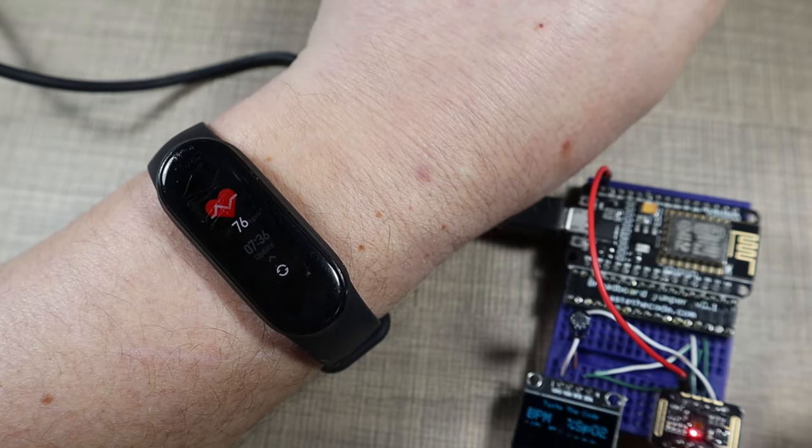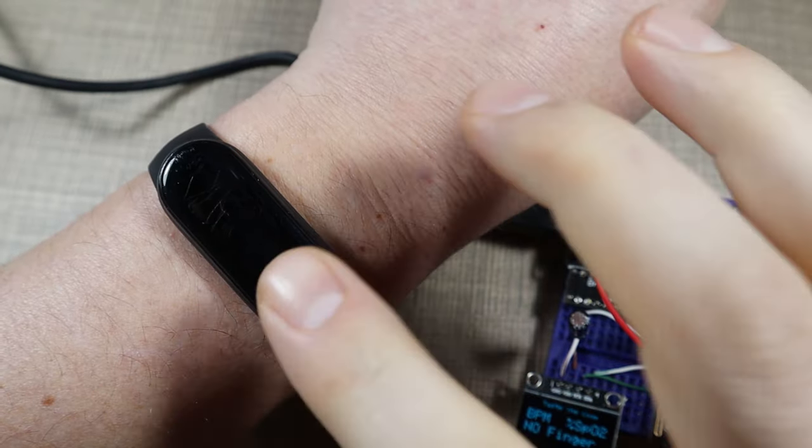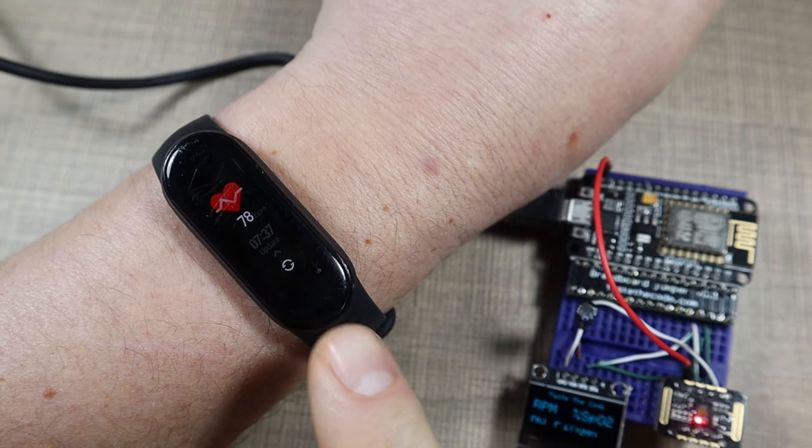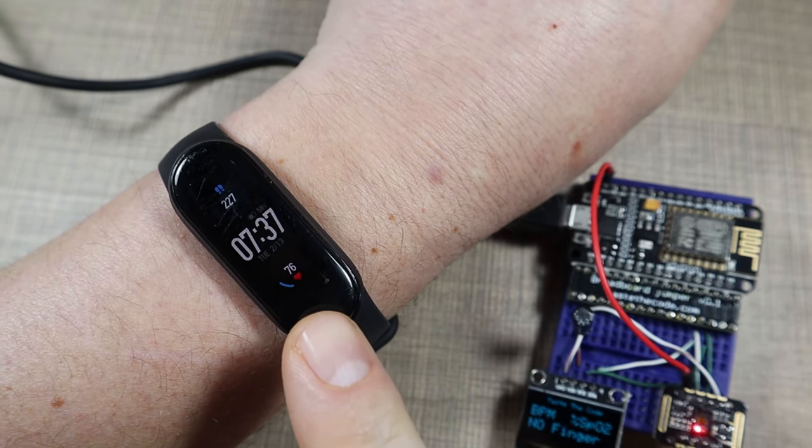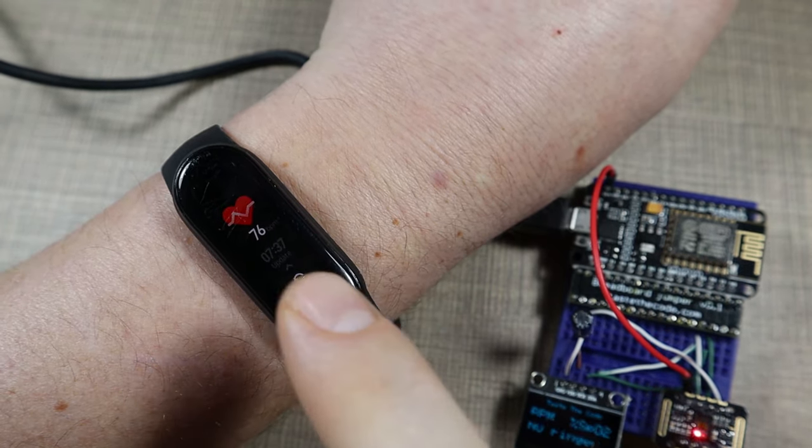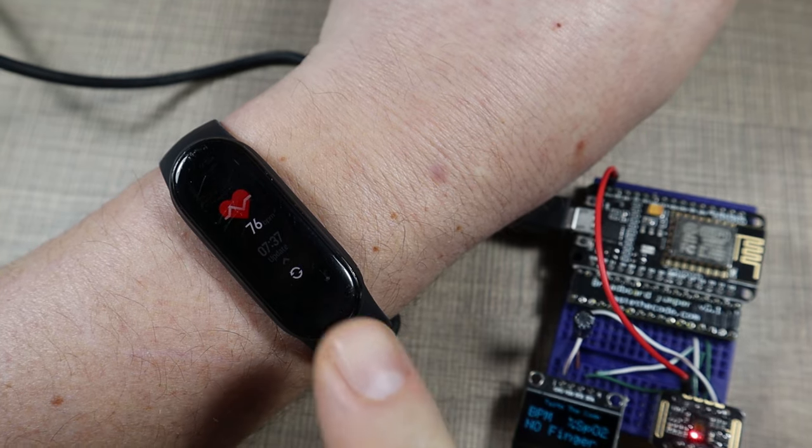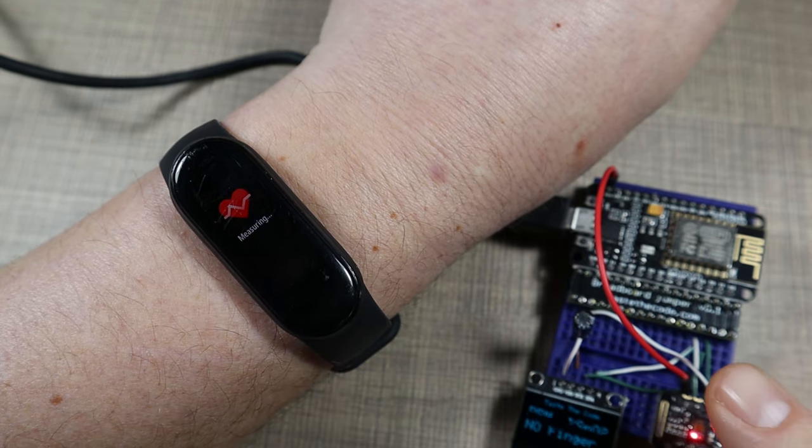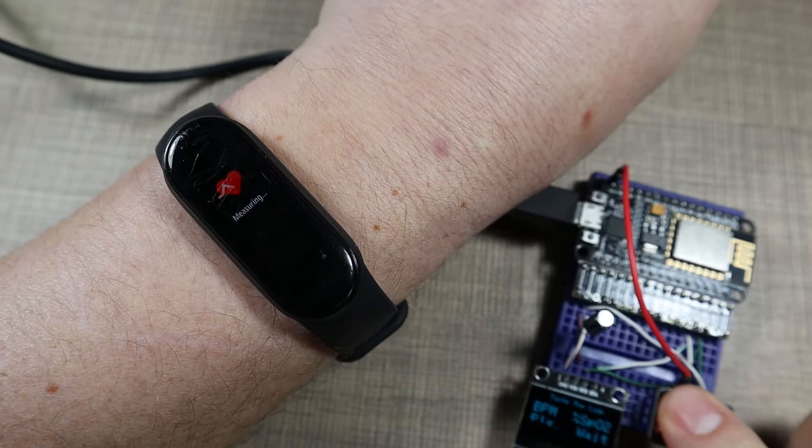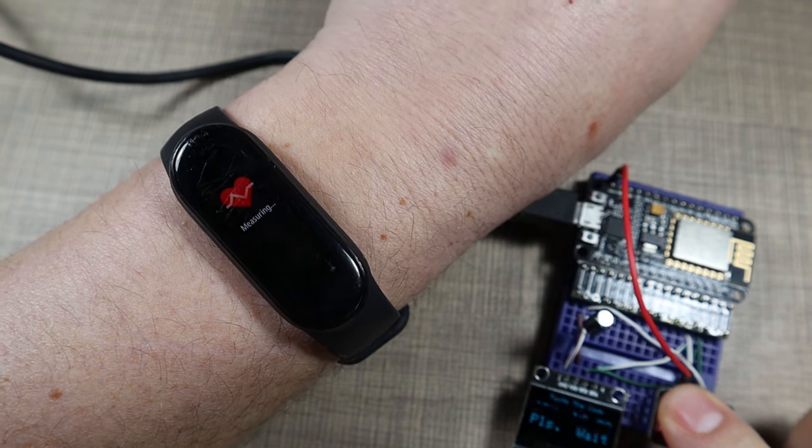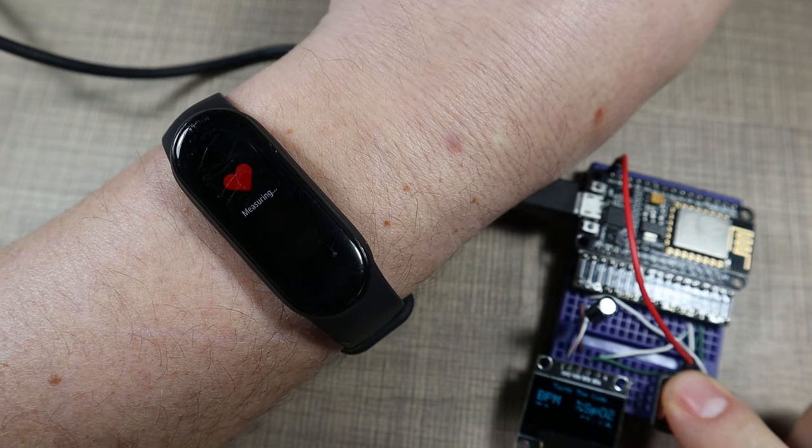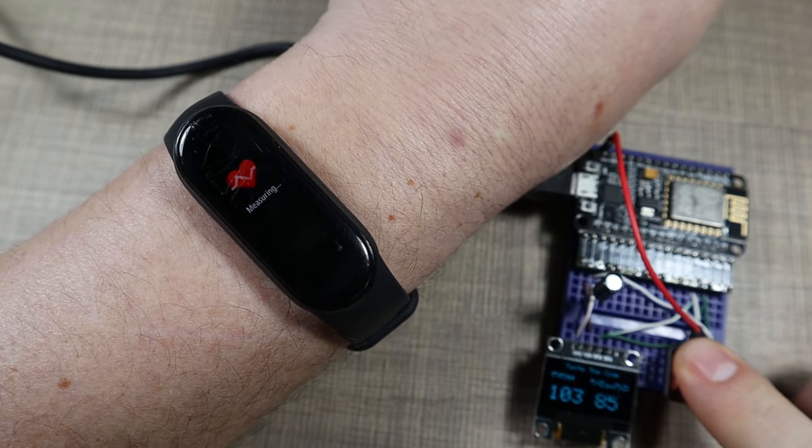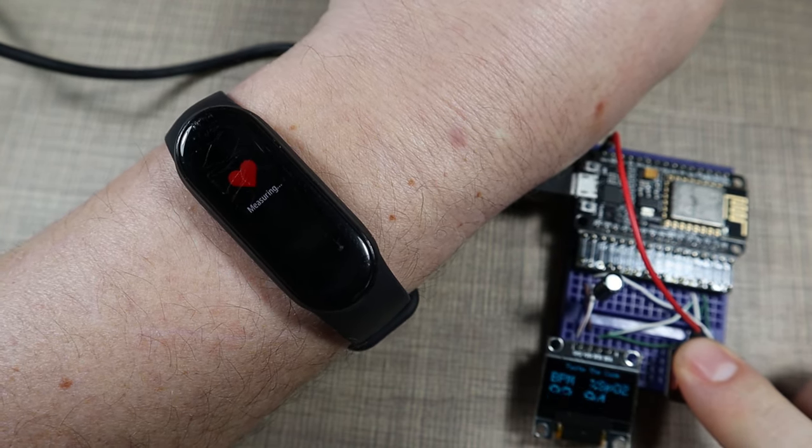Now it's a bit tricky to compare the results of the sensor here with my Mi smart band, but I'll try to do it and trigger the heart rate measuring on both at the same time to see how they compare to each other.